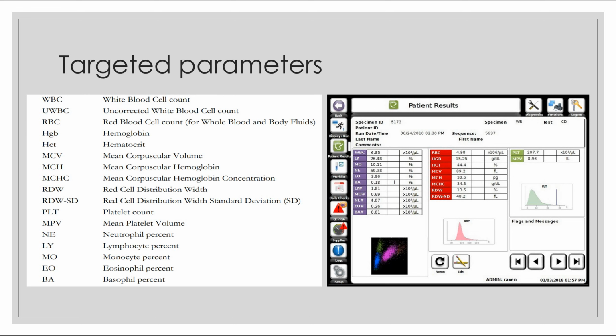Mainly, the issue seen for these kinds of devices is blood clotting resulting from misuse or hardware failure, and usually for this it must be cleaned. But as we've seen in the first slide, these devices are complicated and compressed as they are small. So the only way to deal with this kind of issue is using a Clorox solution, which is kind of tiring for engineers.